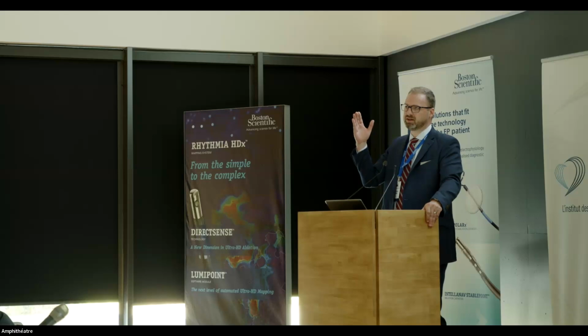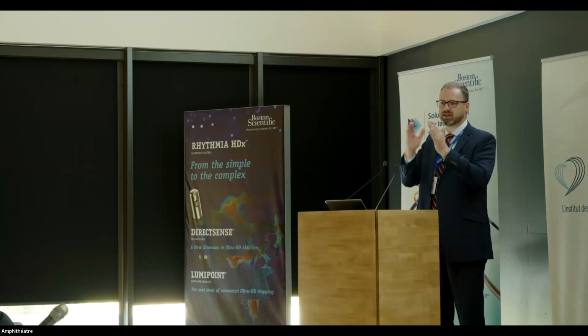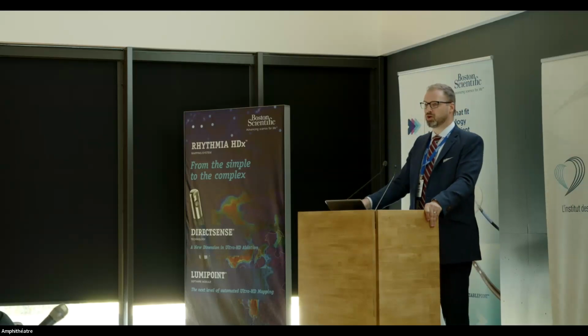So when we talk about breaking a large pulse up into smaller pulses and playing with the spacing and all this stuff, it's a big misconception that we're doing that to almost crack the DNA code of myocytes or something like that.